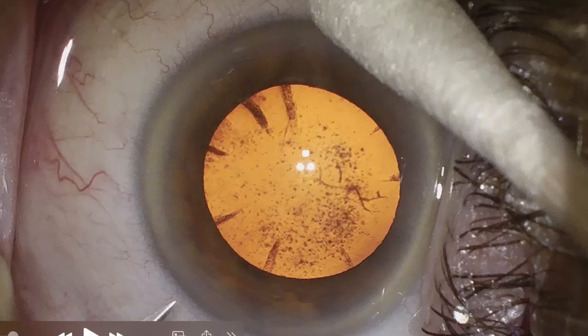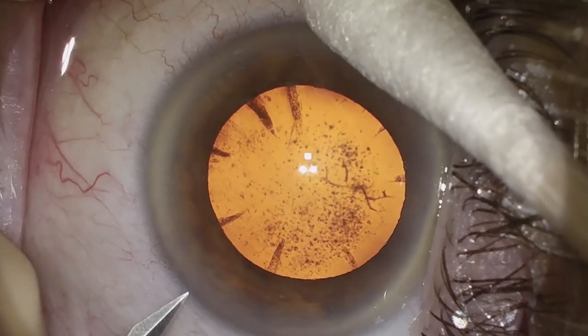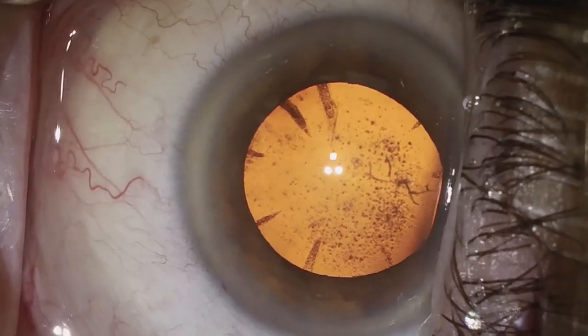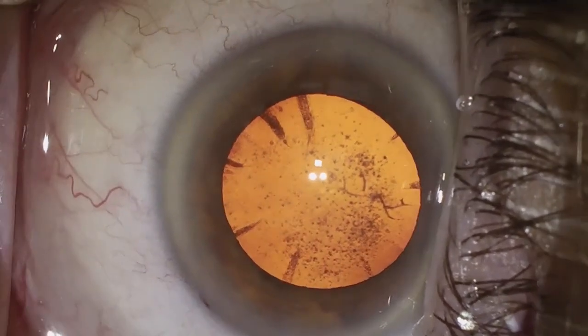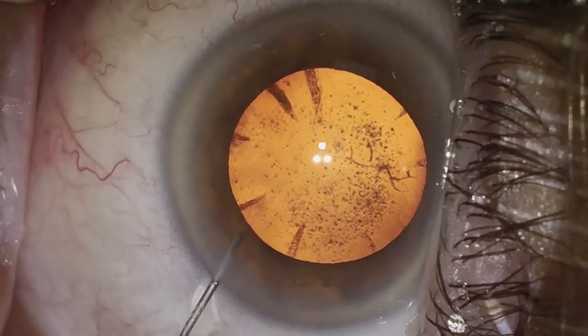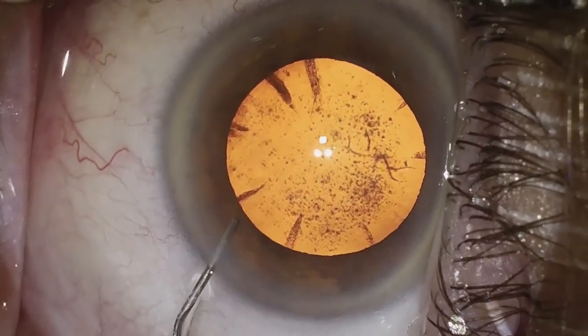How to do cataract surgery in a patient with a corneal dystrophy. Hi, Mohammed Al-Mala here. This is a patient with lattice corneal dystrophy. As you can tell, you can see these marks right here throughout the cornea, and mainly in the right part of the view, as well as centrally and a little bit inferiorly as well.